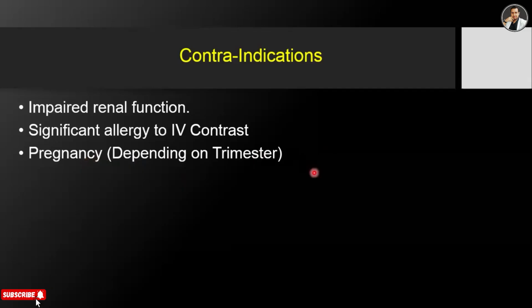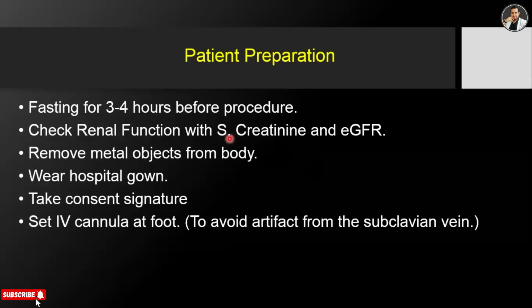Patient preparation is the same in all angiograms. First, the patient needs to be fasting for 3 to 4 hours. Then we will know if the kidney function is good or not by serum creatinine and eGFR. Then the patient's body will be cleared of metal objects.